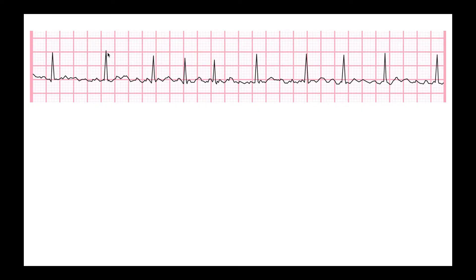If you wanted to be exact, you could take a few measurements of each of them, but you'd find pretty quickly that they're all inconsistent. So because they're inconsistent or irregular, this is an irregular rhythm. With an irregular rhythm, we can't just do the 1500 method or the 300 method, because if we do that method at this interval, it's going to be different at this interval and different at this interval right here. So you'll have a bunch of different heart rates because it's irregular.